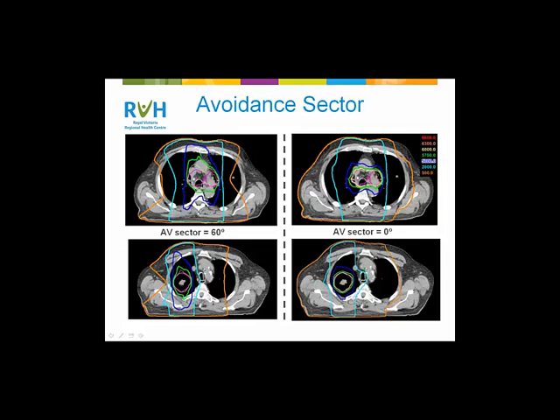With these hybrid high-dose plans, do you worry about meeting other normal tissue constraints such as heart and esophagus? And if so, how does this affect V5? Good question. Yes, we do. Our protocol has constraints for the heart as well as the esophagus. What we found is that the times we've needed to factor in the heart is when we have the heart very anterior to the target. And it's actually not the RapidArc component that is effective for reducing heart dose in those situations. What's more effective is to just tilt the base dose field a little.